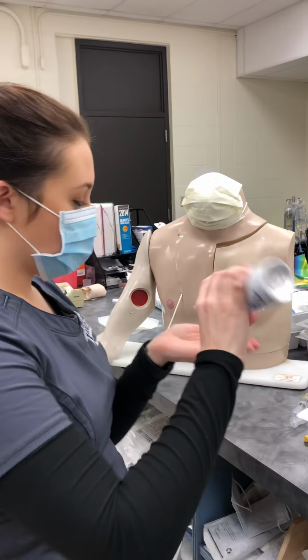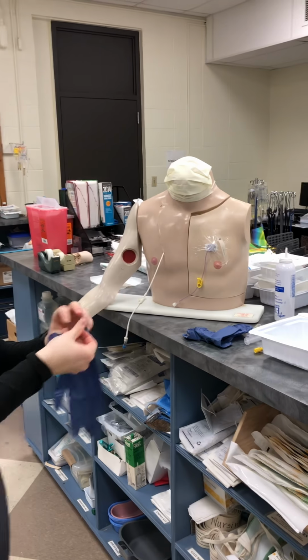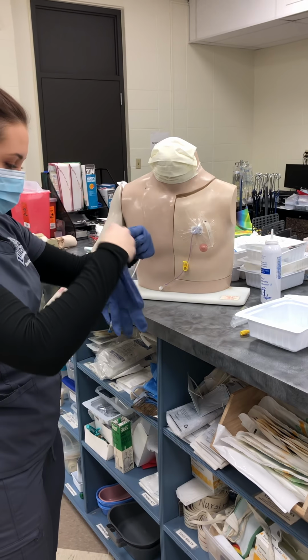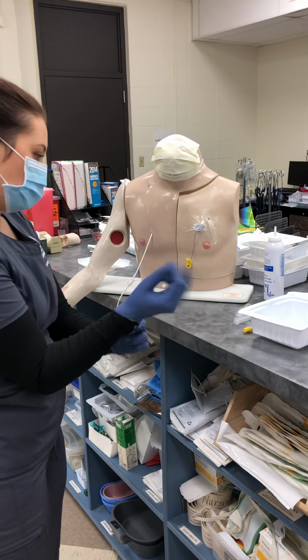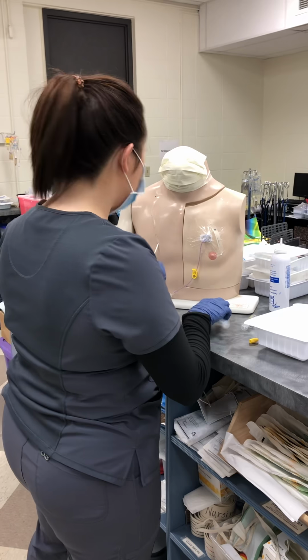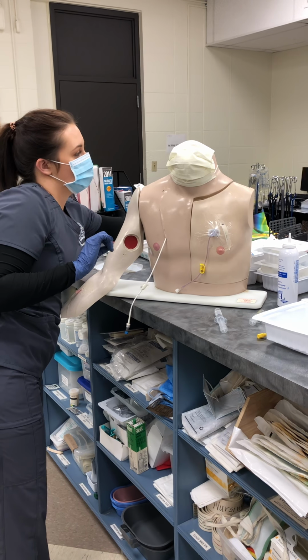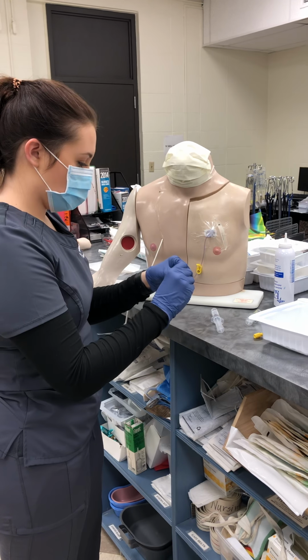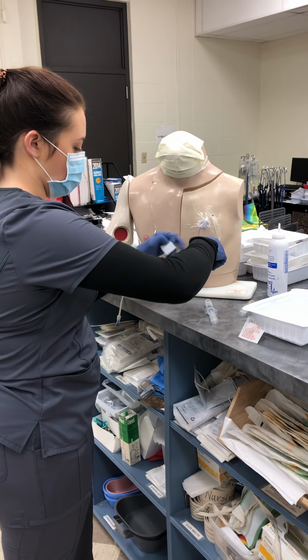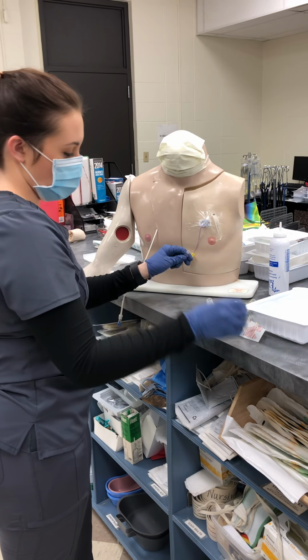You'll wash your hands, put on clean gloves, and clean with an alcohol pad. So you're going to take your cap off your catheter and clean with an alcohol wipe before you access.